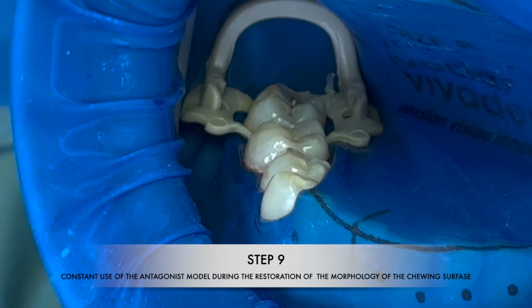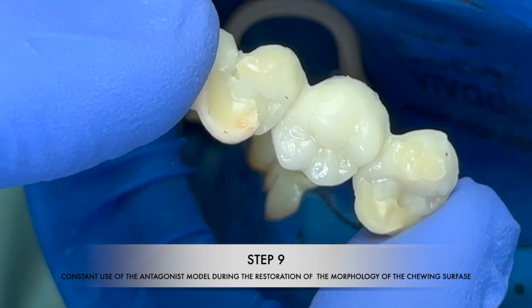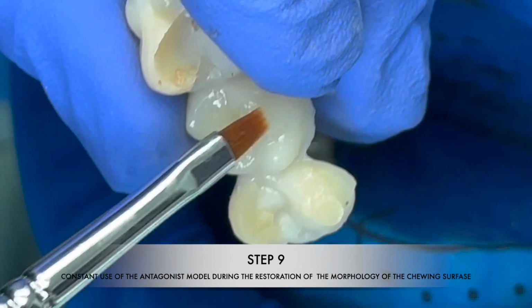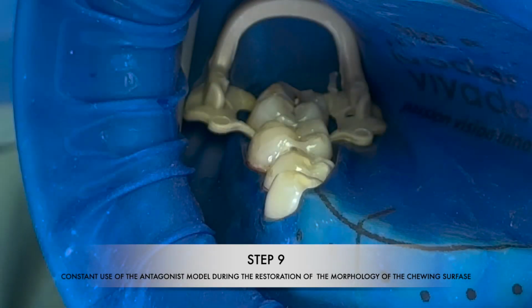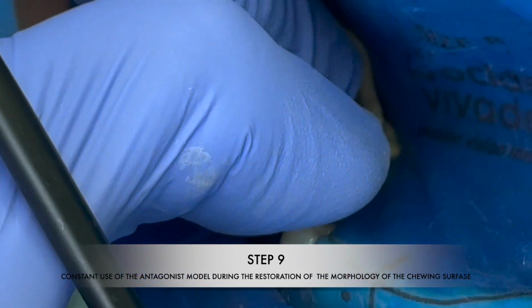Step 9. Continuous use of the antagonist model in the stepwise modeling of morphology. First of all, we take the modeling liquid and apply it with a brush on the chewing surface of the antagonist tooth to block the bonding of the model with the plastic restoration composite that has not yet polymerized.